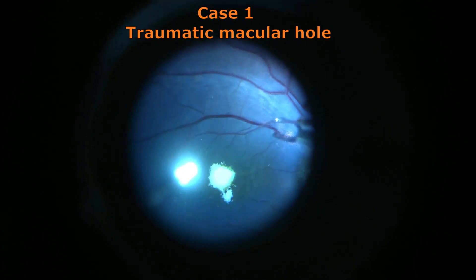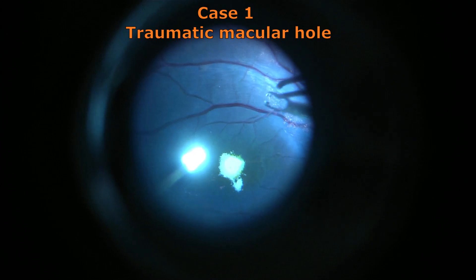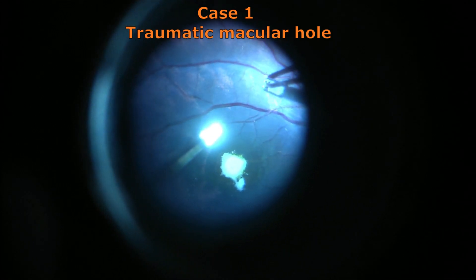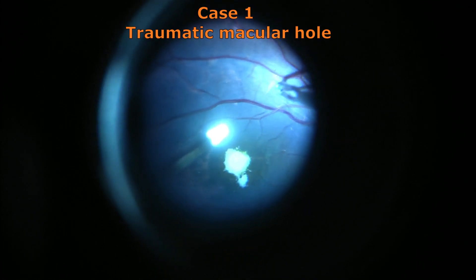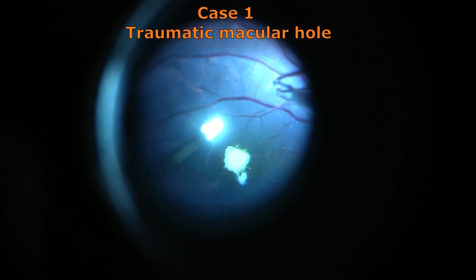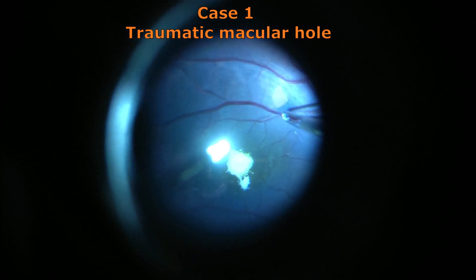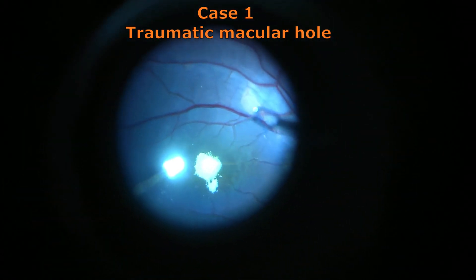One has to proceed first of all to create a flap. This flap can be created by using a diamond dusted membrane scraper or flex finish loop, which will cause a shearing surface traction to simply detach a portion of the flap. But I will demonstrate the pinch and peel technique, which doesn't require any such shearing instrument — you simply approach the surface of the retina and grab the internal limiting membrane using the fine ends of the ILM forceps from Grieshaber.